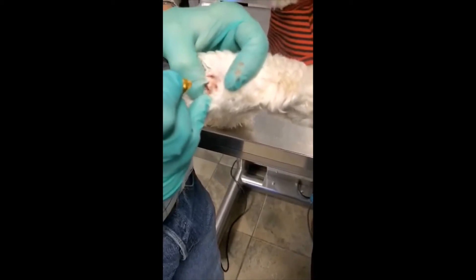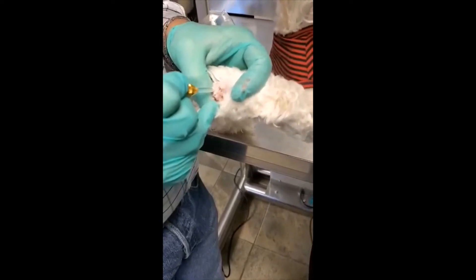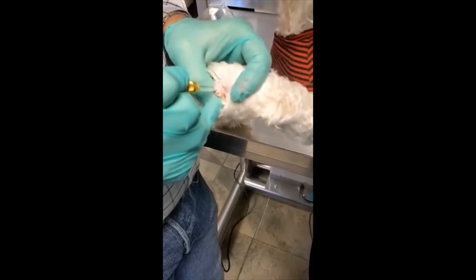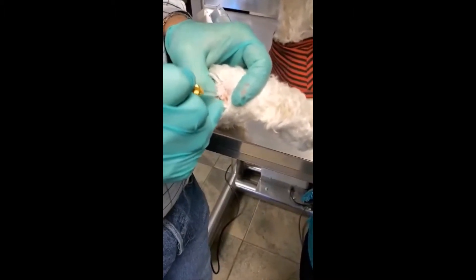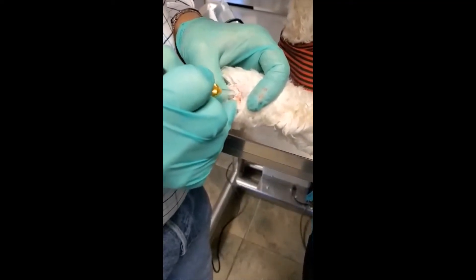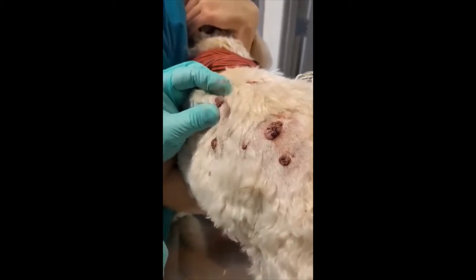This particular distal limb papillomatous mass is both interdigitally as well as right at the metacarpal phalangeal joint. And these tend to elicit a lot of attention postoperatively from Westie-type breeds. So this is what the lesion looks like post-thaw.